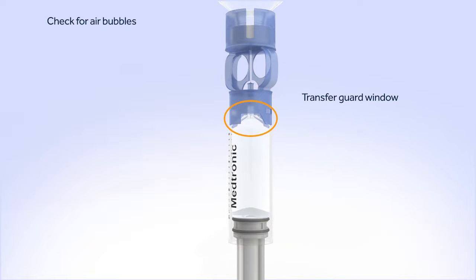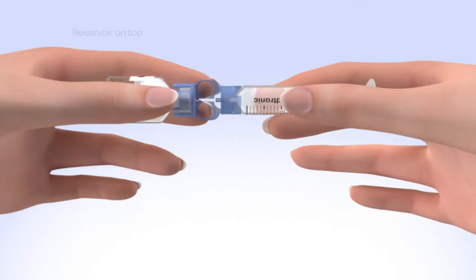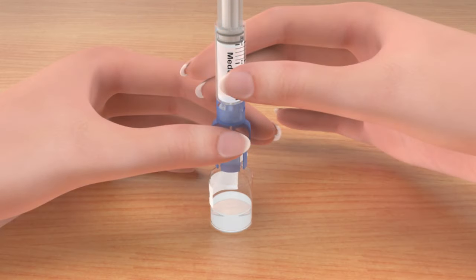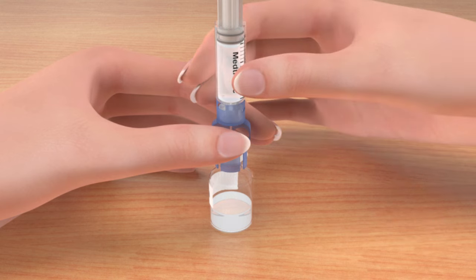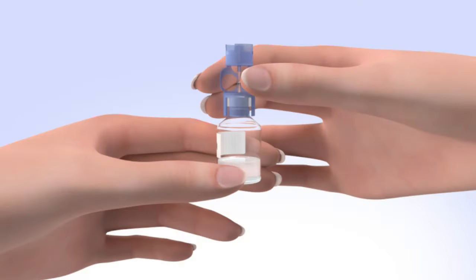Look in the window of the blue transfer guard to make sure no air bubbles remain. To avoid getting liquid on the top of the reservoir, flip the vial over so it is upright. With the vial down on the table, hold the transfer guard with one hand. With your other hand, turn the reservoir counter-clockwise and then pull straight up to remove it from the transfer guard. Be careful not to press on the O-rings. Disconnect the transfer guard from the vial and dispose of it properly.